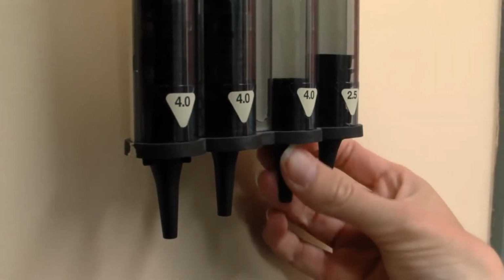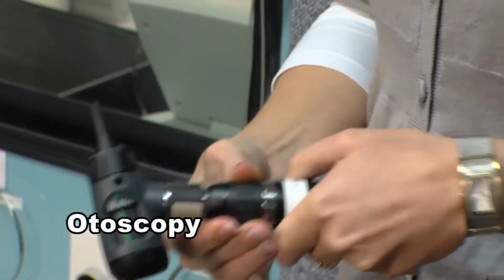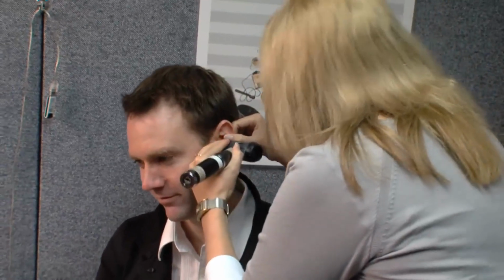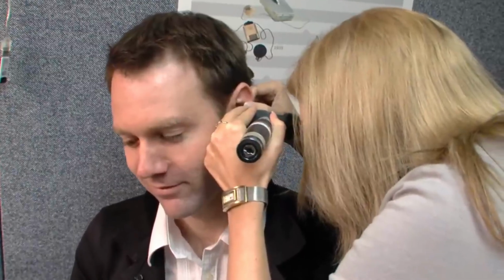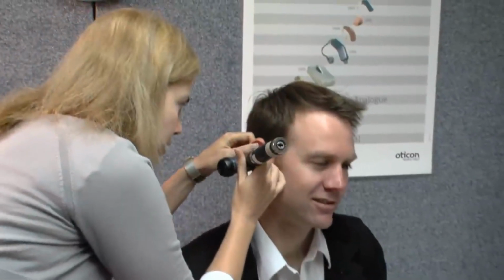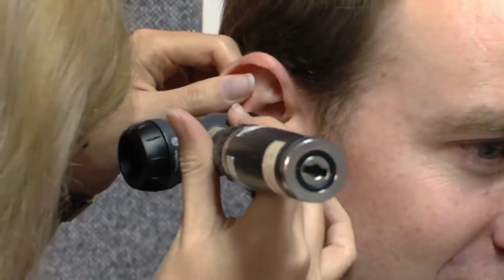So what we'll do is I'll just have a look in your ears for a start and then we'll get on with the hearing test. Important clues about some conditions that may affect hearing can be obtained through an otoscopic examination of the client's ear canals. And we'll just check the other one. Otoscopy also establishes whether the patient's ear canals are sufficiently free of wax or other debris to proceed with testing.